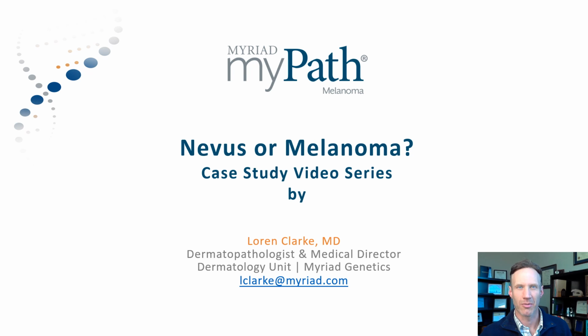I'm Loren Clarke, dermatopathologist and medical director for dermatology at Myriad Genetics. And the purpose of these case study videos is simply to show and discuss some cases that were interesting at both the histopathologic and the molecular level, consider what we might learn from them, and also address some of the questions that sometimes come up about the myPath test and its results.